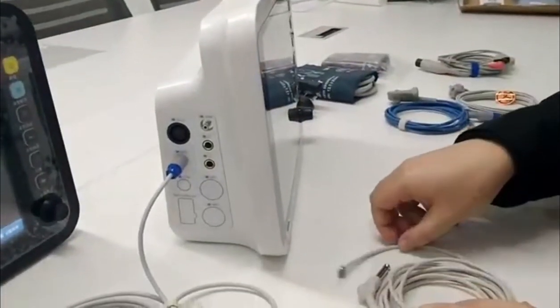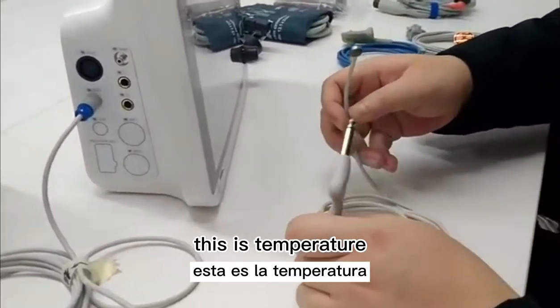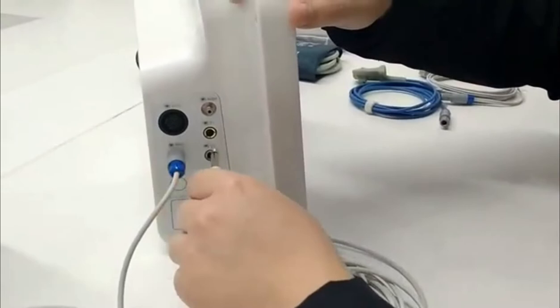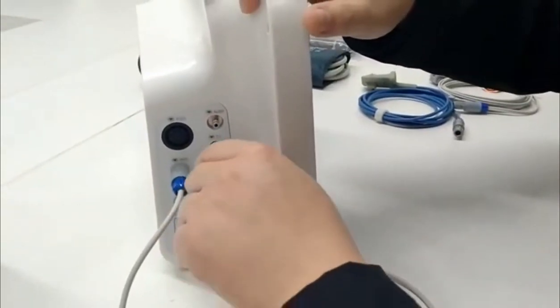This is a temperature probe. Temperature probe one and temperature probe two. Normally one is sufficient.